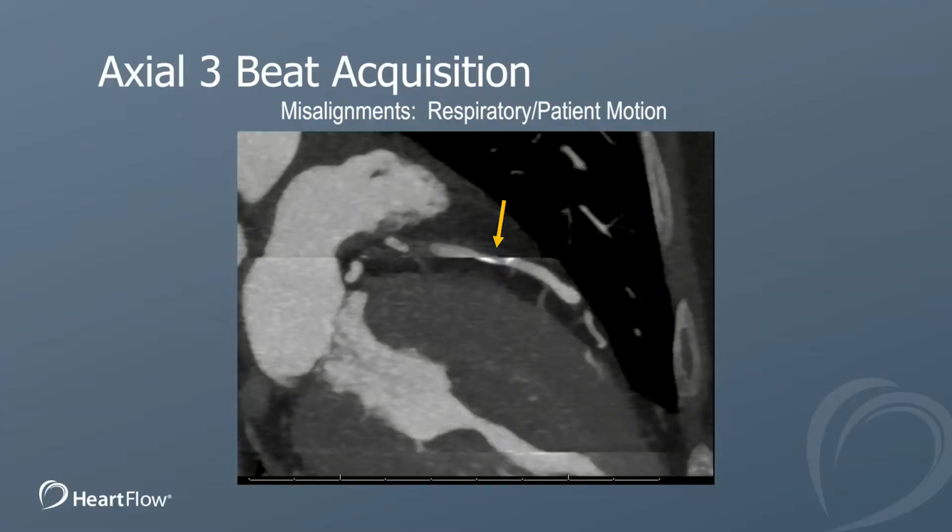This is an example of that same patient who was breathing during the scan, and you can see a marked misalignment artifact right over a plaque. And you can imagine how difficult it is to assess a stenosis in this situation.